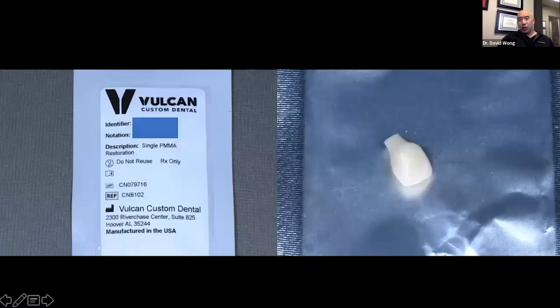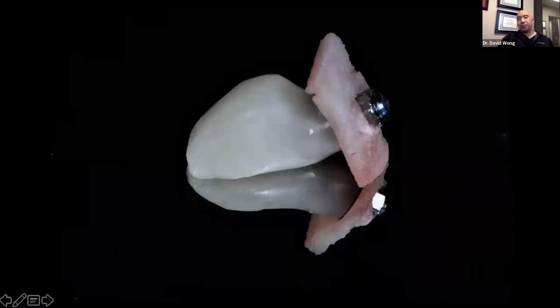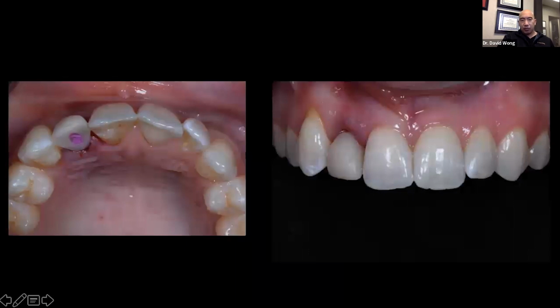So in this situation, this implant was highly stable. So we went ahead and put the provisional on, and it's prefabricated. You can see that we have that reverse S contour at the cervical third, which means we're going to have a concave surface. That's the critical zone of contour. Remember, we pretty much obliterated the whole socket with our implant because it was a pretty short tooth. So we'll graft just a little bit, and then here we're using a little piece of AlloDerm to cover the rest of the socket. And then we're going to screw in our provisional at the same time to preserve our hard and soft tissues.